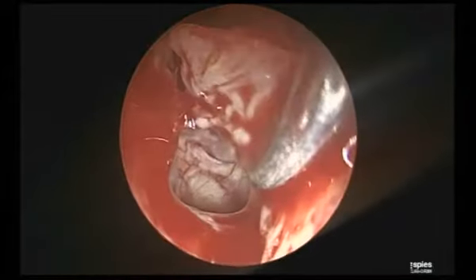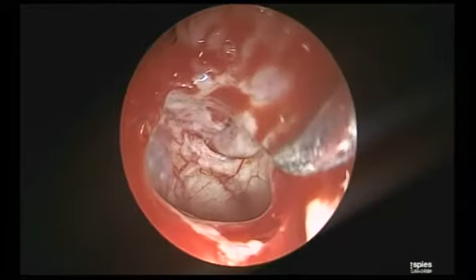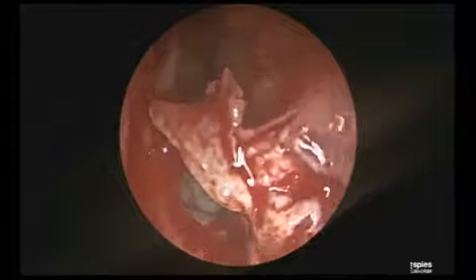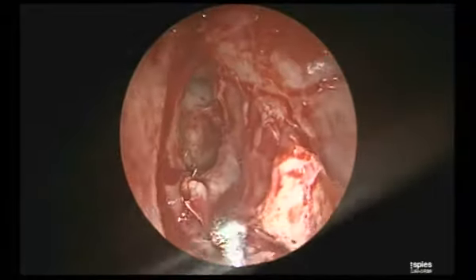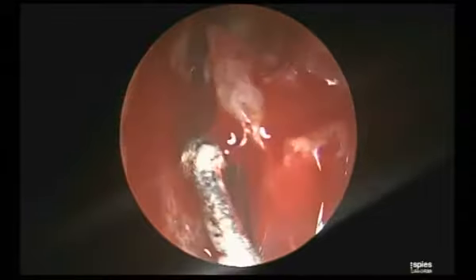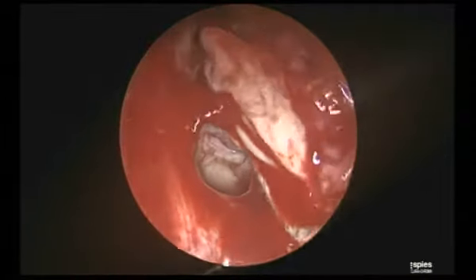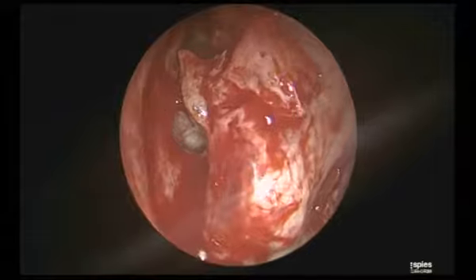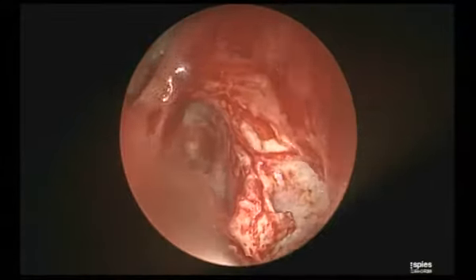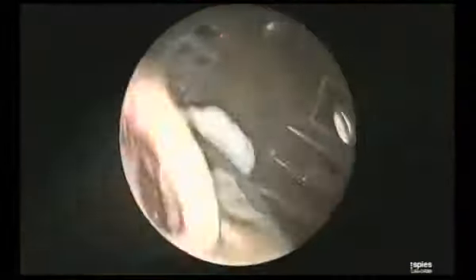Boom! Now, there it is. Can you see it? See now how well protected by the bulla. Why do I need to be concerned with the anterior ethmoidal artery all the time? That's the simple thing. This is the simplest way for the junior colleagues. Don't be so scared about the anterior ethmoidal artery. Stick to your landmark.